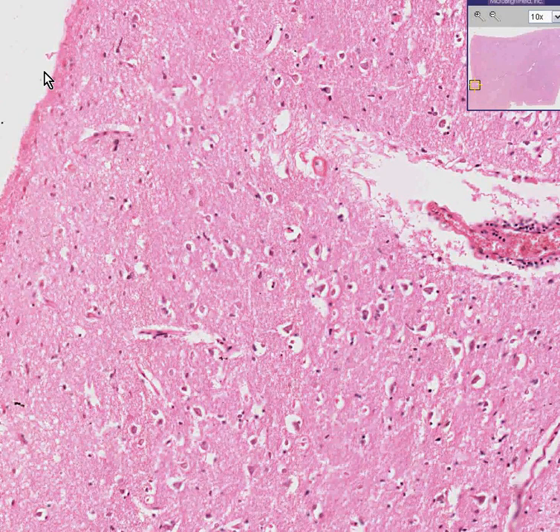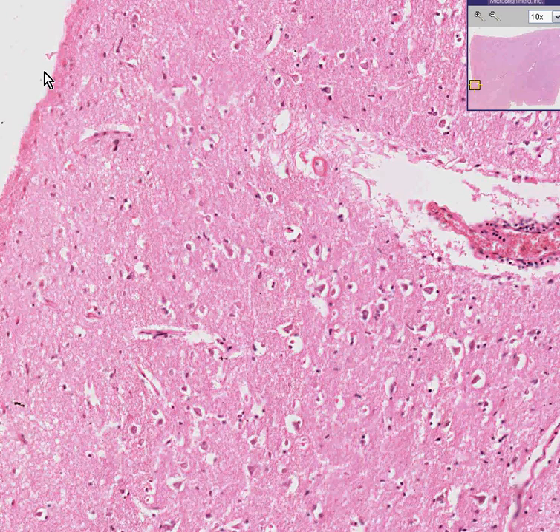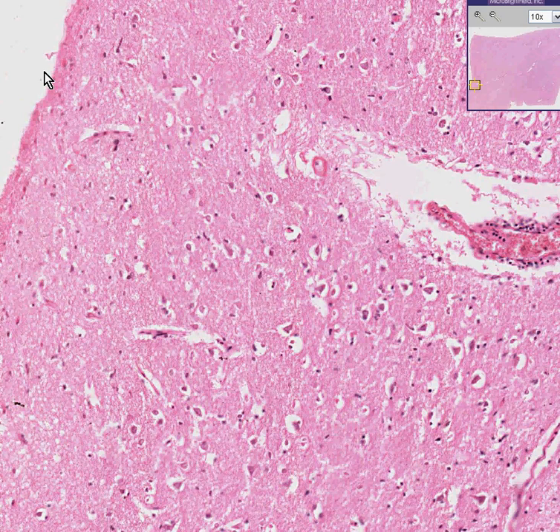I know what you're thinking. You're thinking that this is probably some type of brain tissue. Well, you're thinking right, and that's because it is brain tissue.